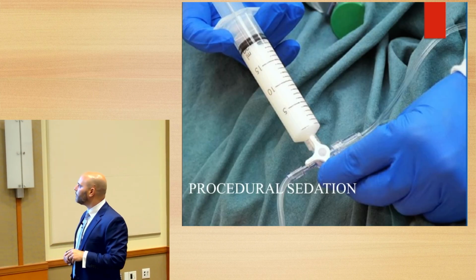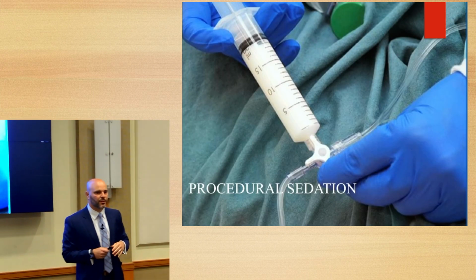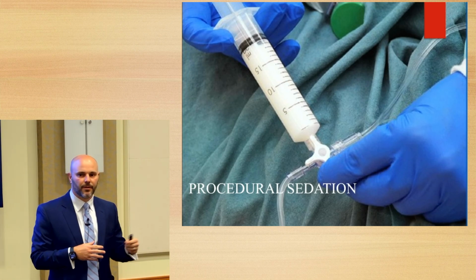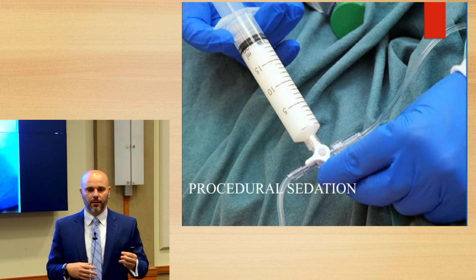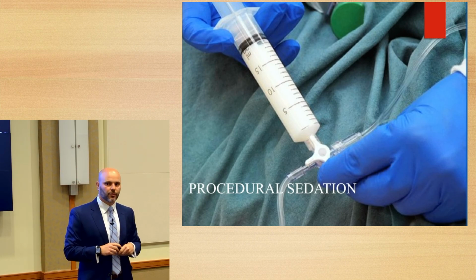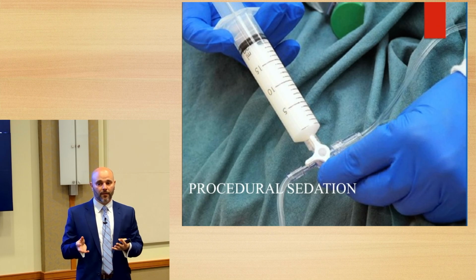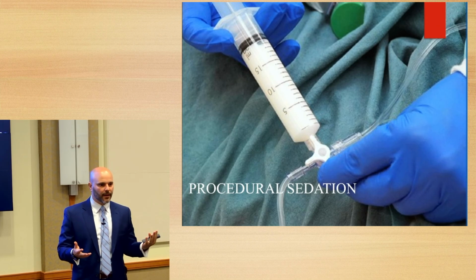Okay. All right, so with this in mind, let's dive into the literature. So particularly with procedural sedation, we're trying to take advantage of the fact that CO2 diffuses about 20 times more than oxygen. So you're going to equilibrate the CO2 a little bit quicker during procedural sedation. Procedural sedation also limits your respiratory drive. So hopefully we're trying to catch the problem of hypoventilation earlier before hypoxia takes effect, right?